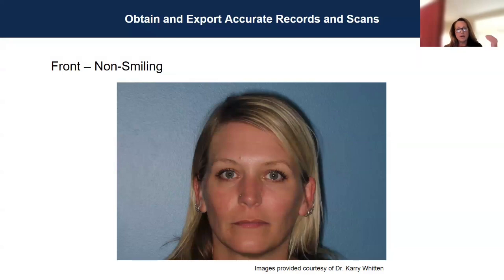I don't like a big shadow. In the office that I worked at, I went to Joann Fabrics and got a dark navy blue felt that I would bring out, and I had a little nail that I would just put it on, and then have my patients do their photo shoot there so they could model.